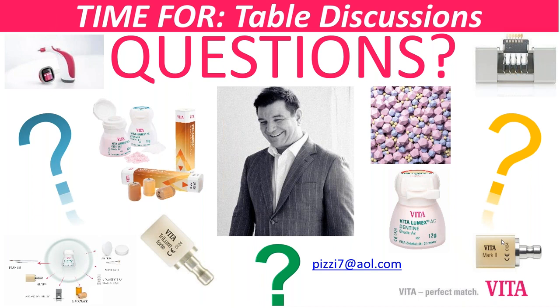That's one challenge. Second problem is, and I know you guys are probably hearing the studies that are telling you that zirconia is etchable. Yes, it is etchable. If you etch it for 30 minutes, that changes the crack propagation of the material and that becomes problematic. And even after you etch it for 30 minutes, is it really a great bondable material? My answer is not today. It won't be for a while.